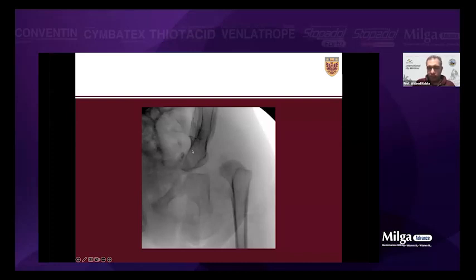Excellent point. So do you guys clean off the small muscles on the capsule, or do you just do the capsulotomy right away? Capsule open. Perfect. I take my time to clean off the capsule from the small muscles, iliocapsularis or whatever muscles, and clean all. Excellent. Remove the muscle first. Some surgeons do not do iliopsoas tenotomy, as it acts as a barrier to anterior dislocation after capsulorrhaphy.